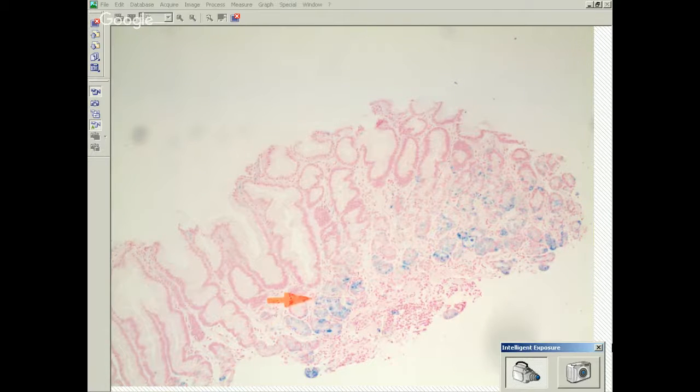And this happens in iron overload syndromes. It also happens in alcoholics, patients with liver failure, hemochromatosis, that sort of thing. So it's different from what we saw in the previous. Yeah, exactly. So it's also iron, except that the iron isn't in the form of a pill in a lumen. It's actually within the cells. Yeah, alcoholics, transfusion dependent patients, it's fairly rare.